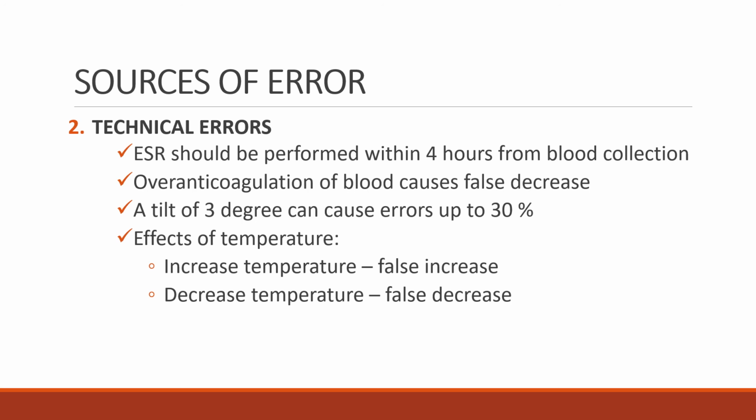In terms of the effects of temperature on the result, increased temperature falsely increases the ESR, while decreased temperature falsely decreases the ESR.